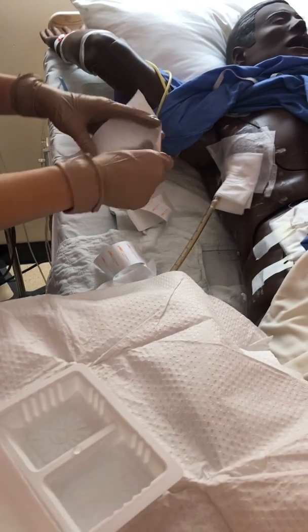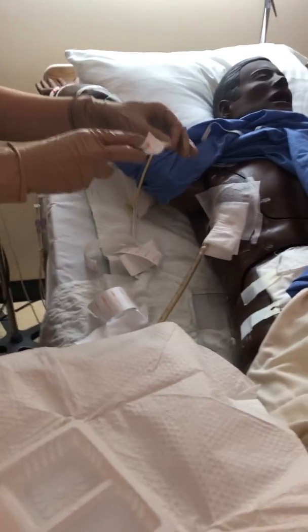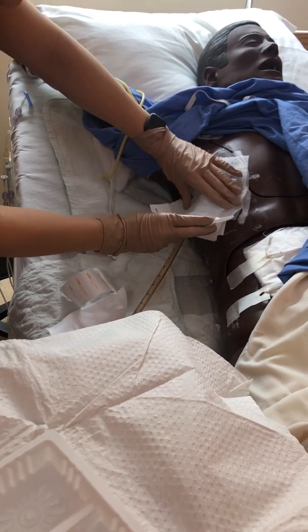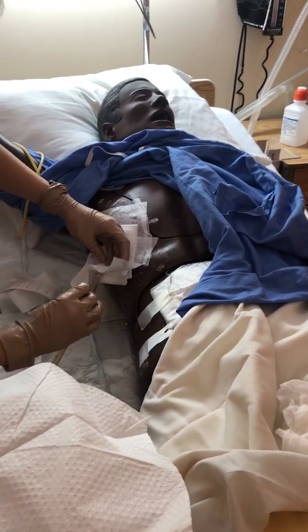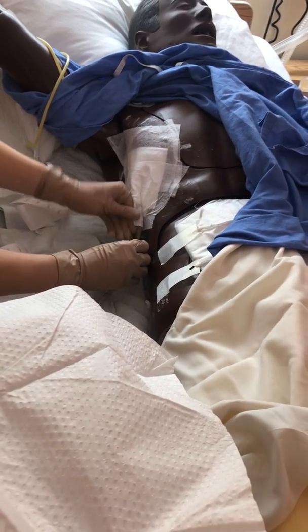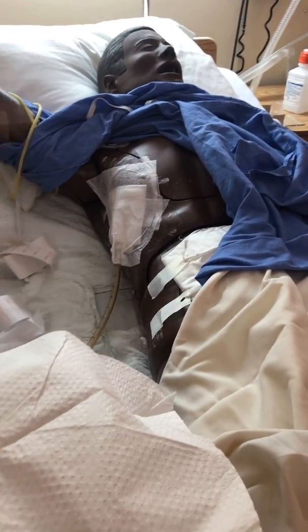And then the one here that I have designated with my signature, date, time, it's going to go, fold it back. So again, I wouldn't want to use this one, I'd want to get a new one because we want to make sure that the dressing underneath is sterile, but for demo purposes, we're still going to use this one here. So we want to make sure this is occlusive again, and then pull this off here. And then around the tube here, we want to do tenting so that if he pulls on the drain, it pulls on this and not pulling the drain out. So we tent that there. Everything is occluded, sealed, good.